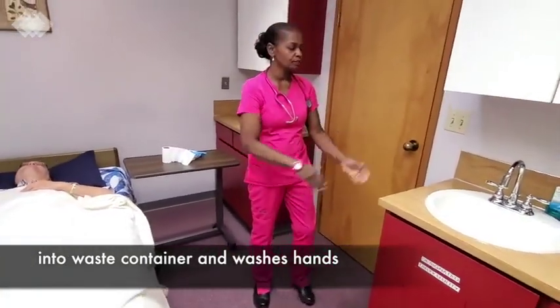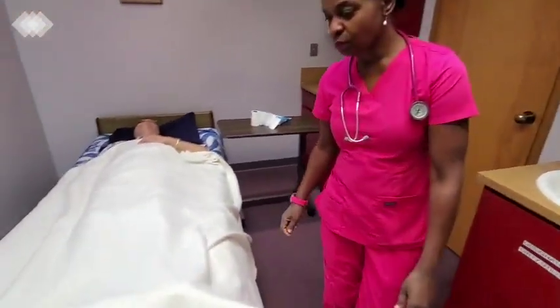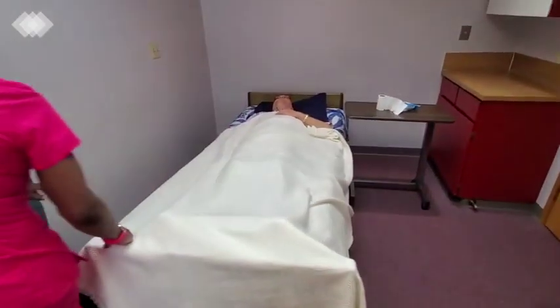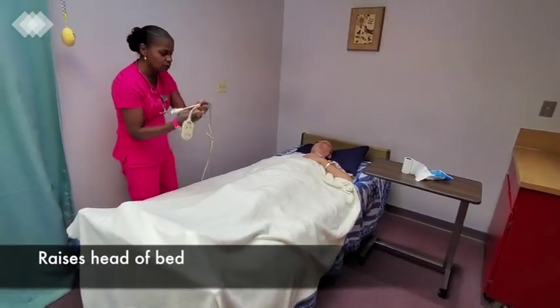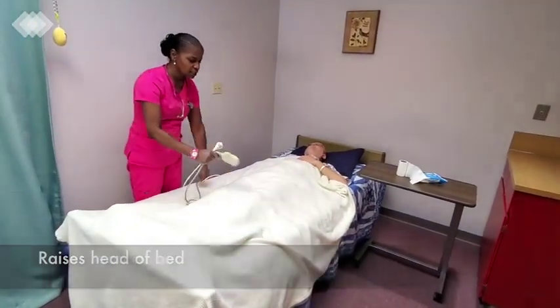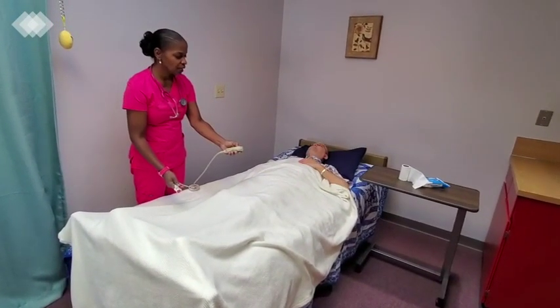I will then remove my gloves immediately after putting the bedpan in. Throw them in the garbage and wash my hands. Now, Peter, I'm going to lift the head of your bed up now for a little gravity so that you will use the bedpan.